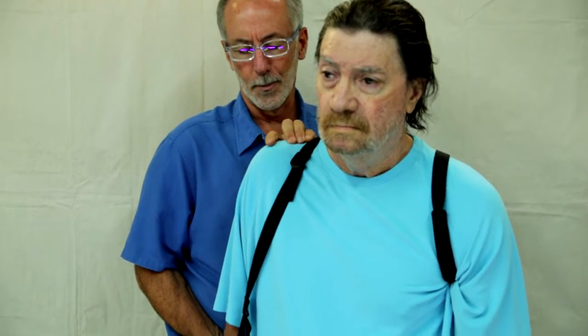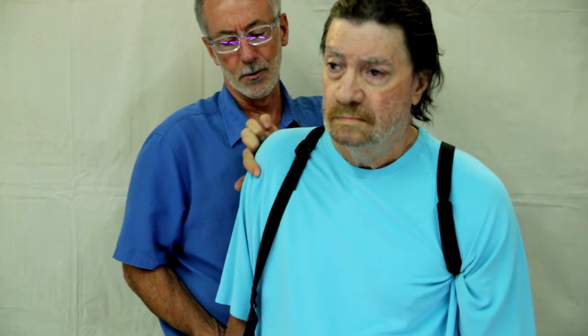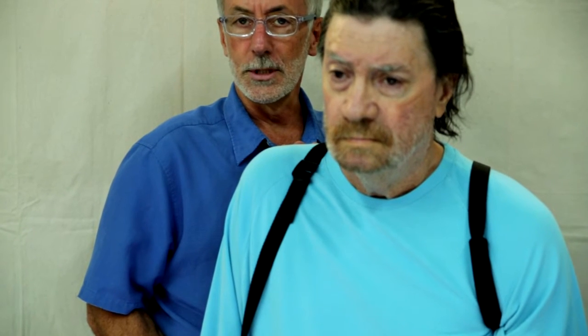So when we talk about reducing subluxation, I invite you to do this with your client or your family member. Just by lifting from the elbow, I can lift the arm up — can you see the difference? Now it's nice and rounded here. We've reduced the subluxation.